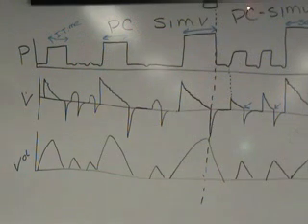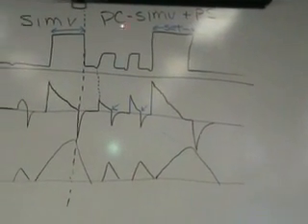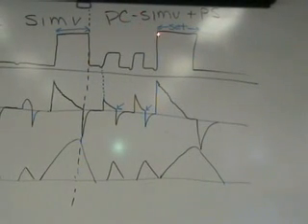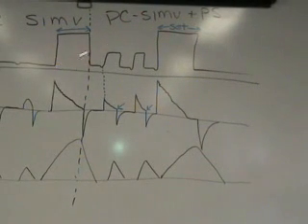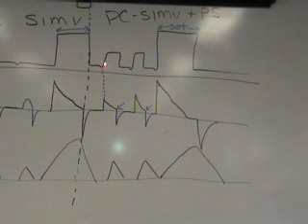If I have to explain pressure control and SIMV with pressure support, I would say the pressure-controlled breaths are either time-triggered or patient-triggered into inspiration. They're pressure-limited, and they're time-cycled into expiration. The pressure-supported breaths are only patient-triggered, pressure-limited, and flow-cycled into expiration.